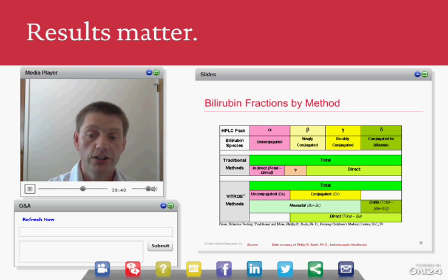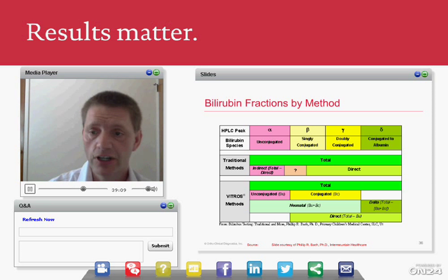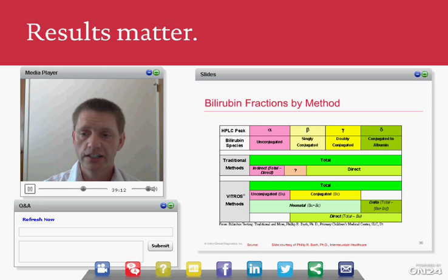In an adult sample, any of this delta bilirubin would not enter into the BBC slide. So in order to get a measure of direct in adults, you would need to run both a T-bil slide, which measures all of total, and a BBC slide, and subtract out the unconjugated, because the unconjugated will all actually go into the BBC slide.